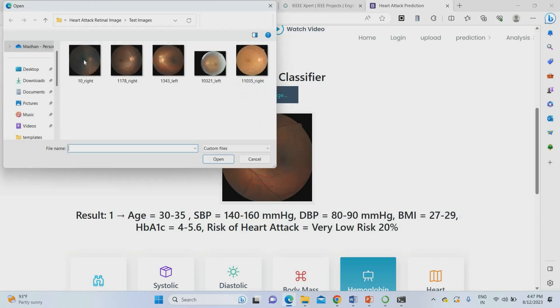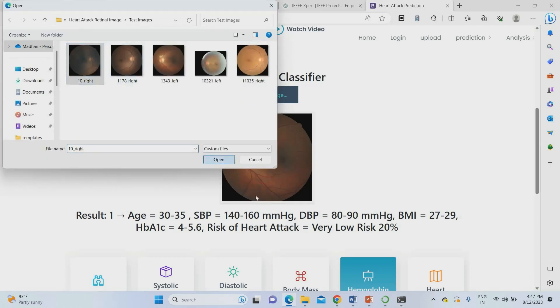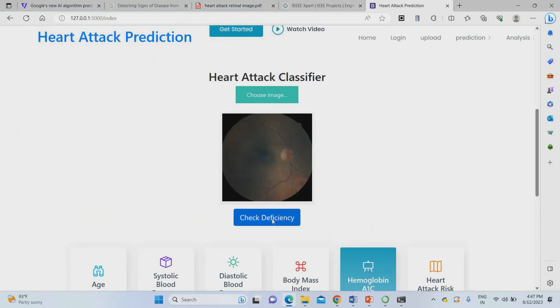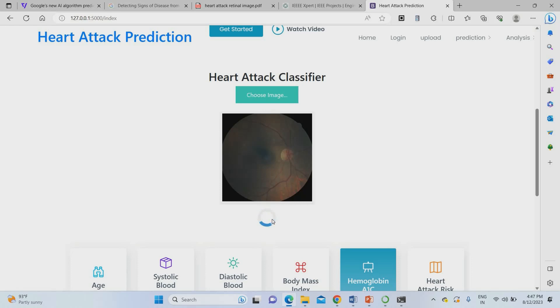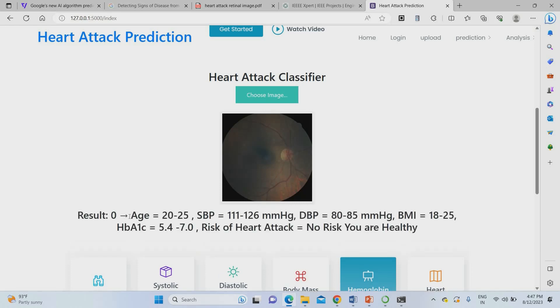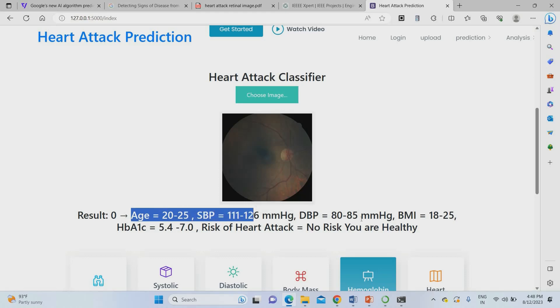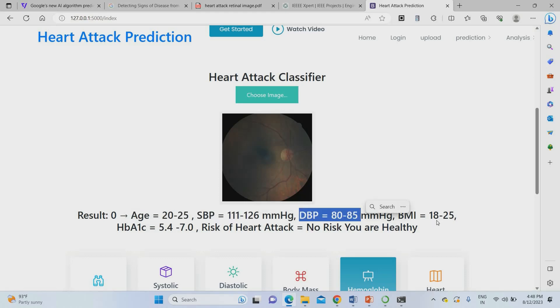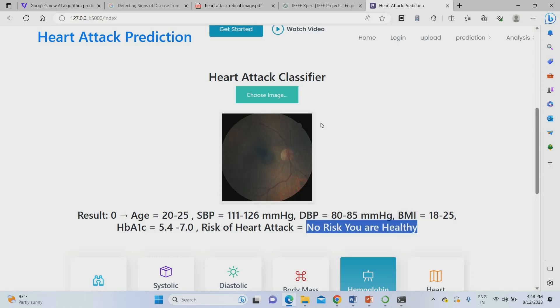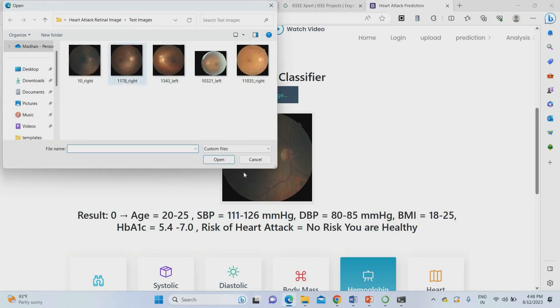We can upload another image for testing. Just upload and check. The result: age was 20 to 25, with corresponding systolic blood pressure range, diastolic blood pressure range, and BMI range. This person has no risk of heart attack.